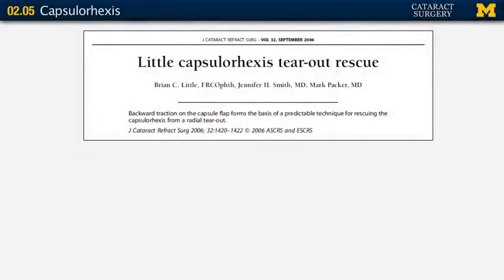So what do you do if your capsulorhexis starts to go radial? It's a very scary moment in cataract surgery, but fortunately Dr. Little described a technique that works the vast majority of times. As long as you recognize early enough that your capsulorhexis is starting to propagate peripherally, you can usually bring it back to center.